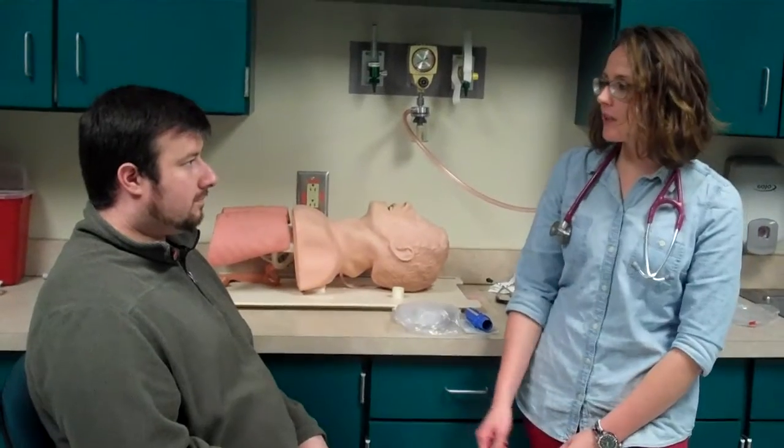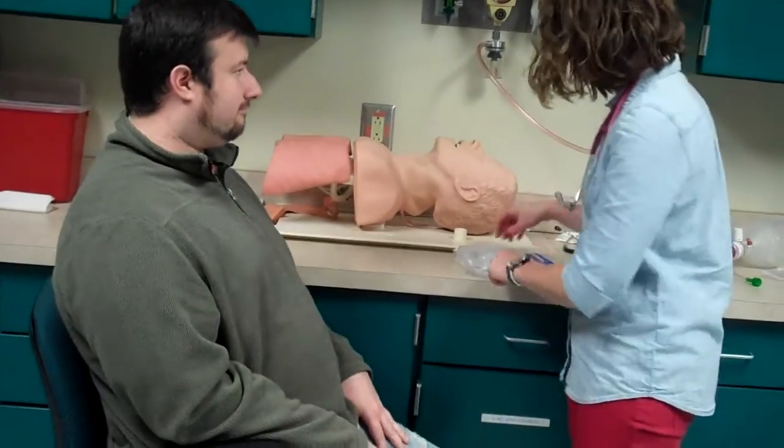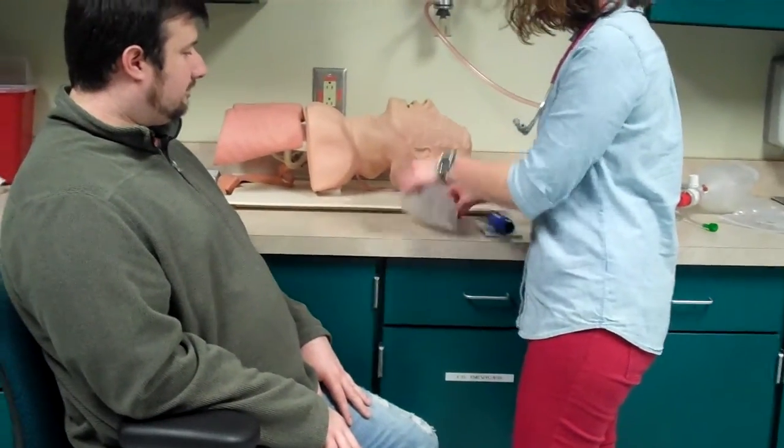Okay. How does his color look to you? He looks all right. A little pink, got a little peachy pink going. And how's his breathing? Got a little rough breathing going. Probably needs a little something to open him up a little more. Okay. And how do you feel? Probably on a scale of 1 to 10, 10 being the worst as far as your breathing goes. What do you think? 5, shortness of breath. 5. Okay, so about in between. All right. This will probably fix it, make you feel a little bit better. You ready? Do you have any more questions? Okay. All right, I'm going to go ahead and set this up.